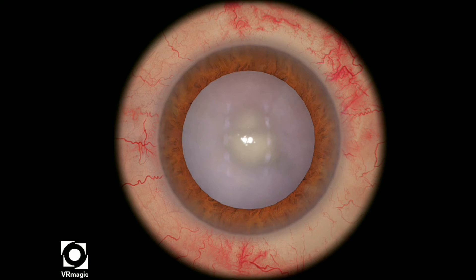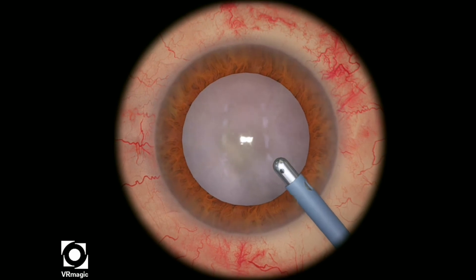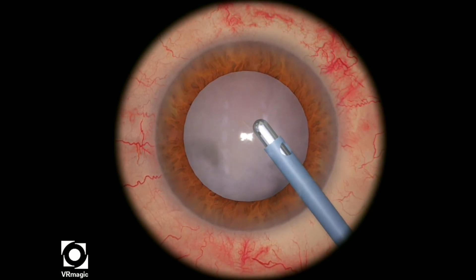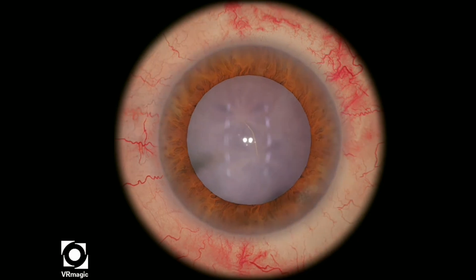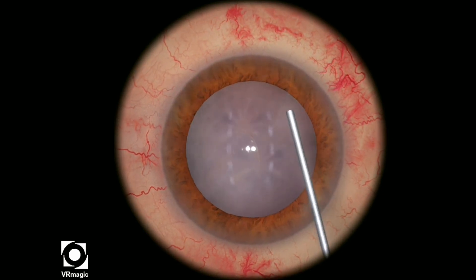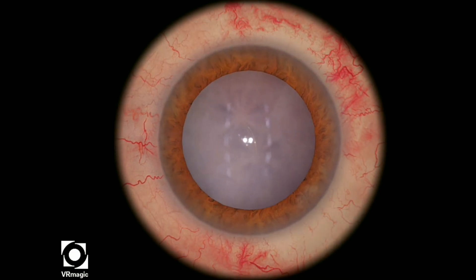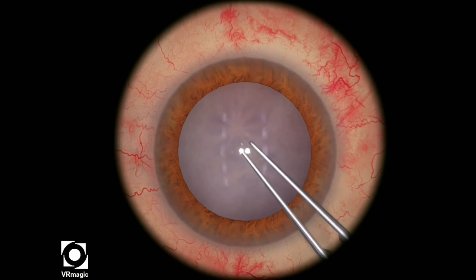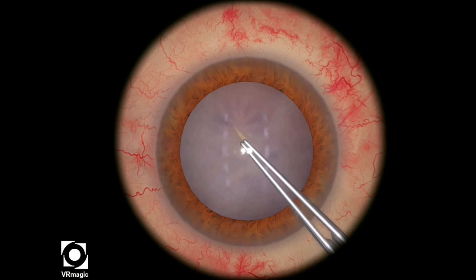Set your IA to continuous irrigation and a very low aspiration level or vacuum level. Point the IA tip towards that area. You'll notice that the capsule is wrinkling a little bit and then most of the white has been aspirated as well. Then you can start your rhexis — fill the AC with a lot of viscoelastic, a very generous amount. Then use your forceps and continue to propagate the capsulorhexis flap.